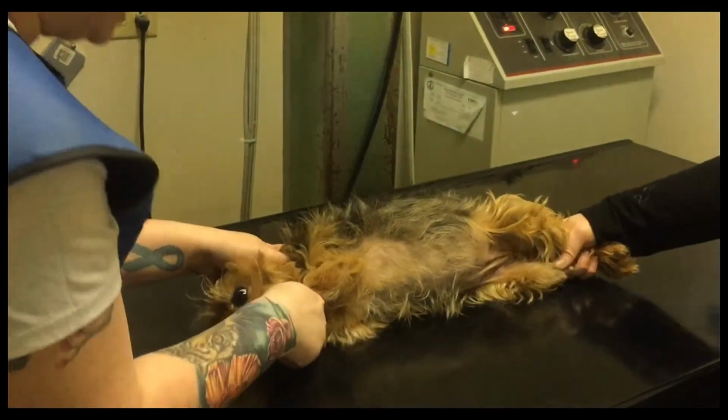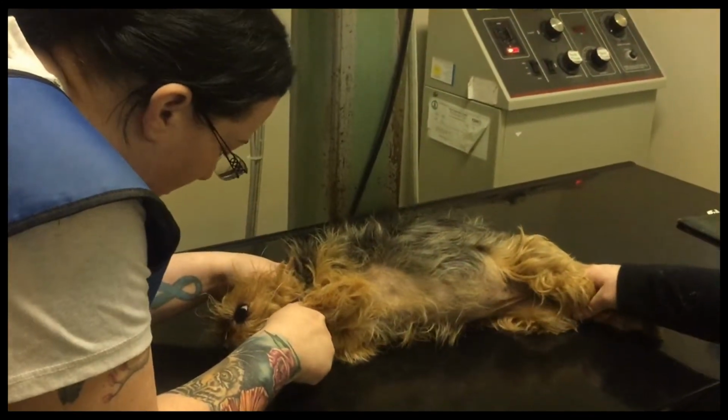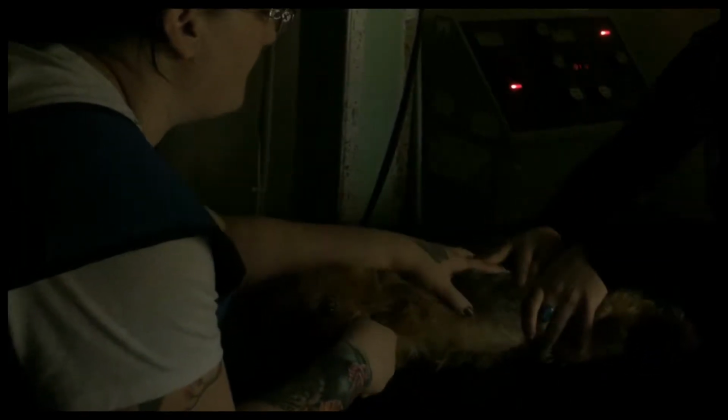Measure at the 13th rib. The cranial portion should be at least 3 rib spaces cranial to the xiphoid, and the caudal landmark is at the greater trochanter.